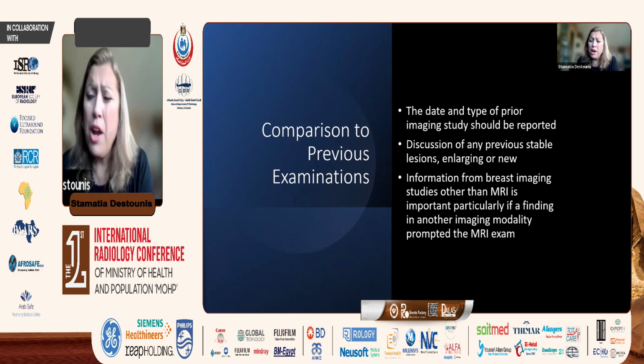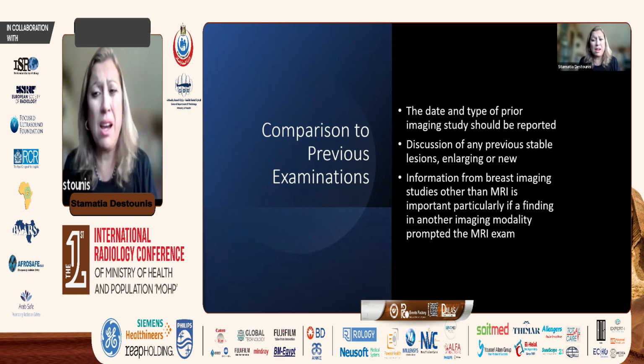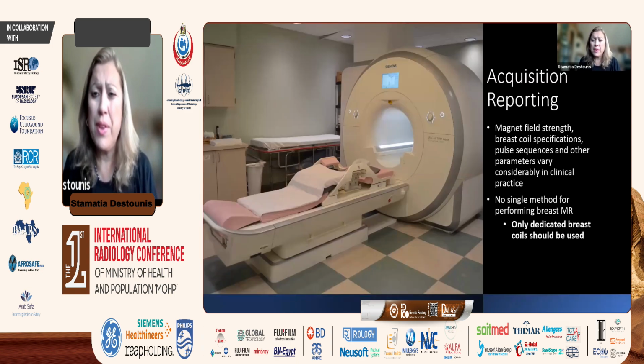If we have a prior mammogram or ultrasound or contrast enhanced mammography study that actually found something and that led to this MRI exam, we have to mention the date and what the finding was, because if that's what prompted this examination, we kind of have to close the loop and be very thorough when we explain this to the patient and her clinical team.